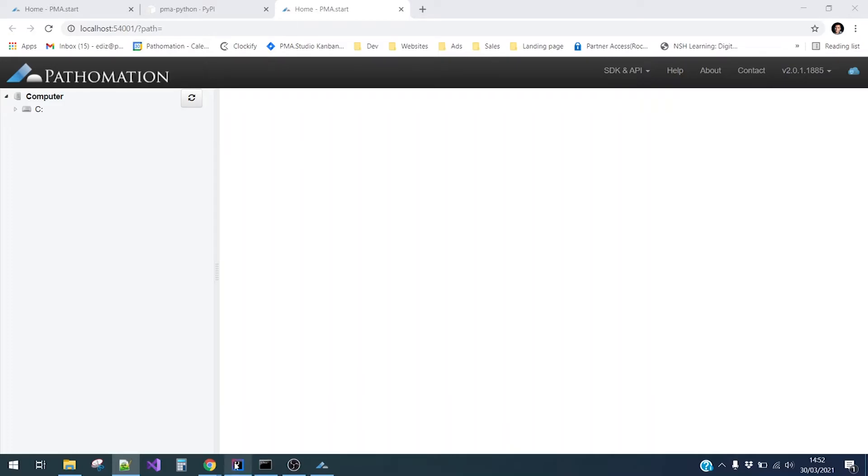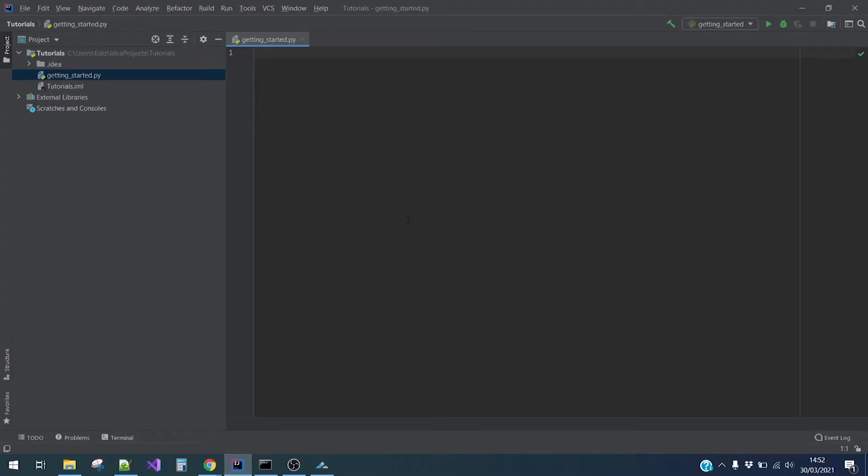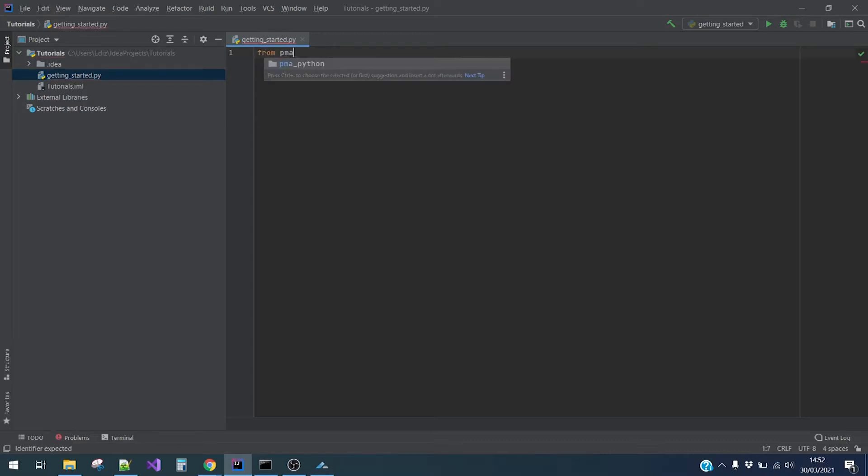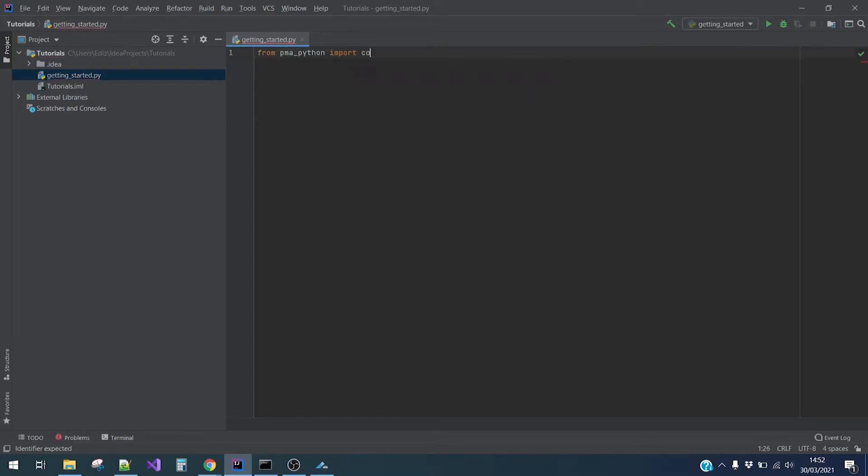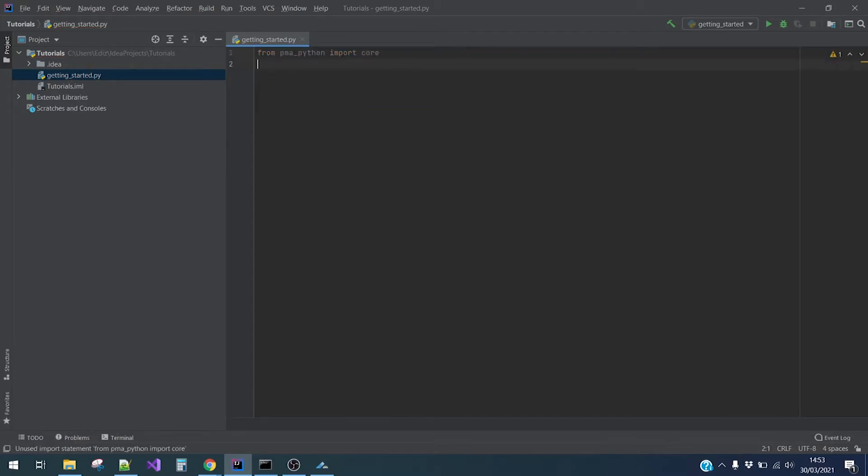Now that we have PMA start running, let's go to our Python code. We'll begin by importing the core module from PMA Python. Write from PMA Python import core.